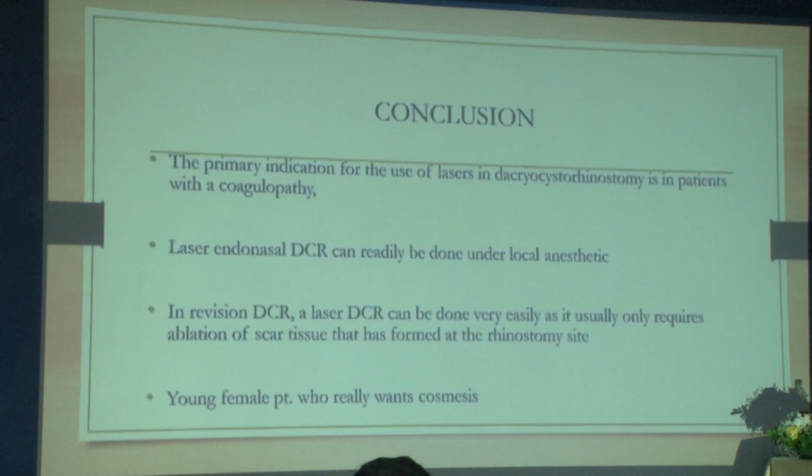To conclude, endoscopic or laser DCR should be preferred in young female patients, as it is really better for cosmesis. It should also be performed in failed cases, and of course in patients on anticoagulant medication.